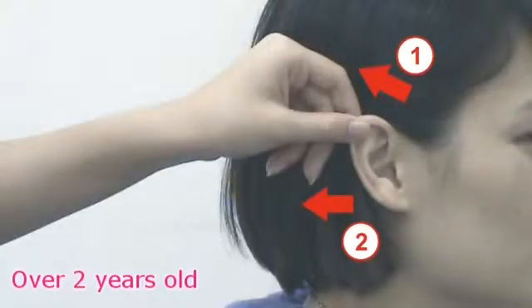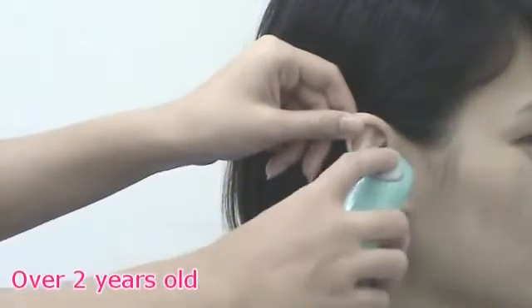For people over two years old, pull the ear up and backward. Then put the probe into the ear canal.